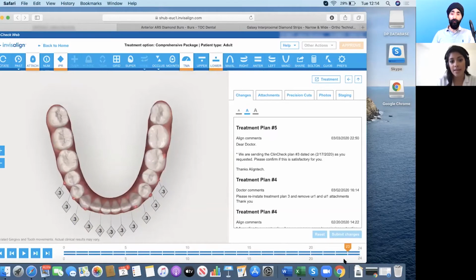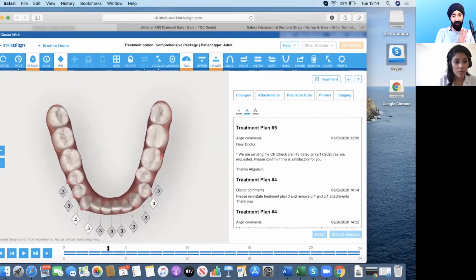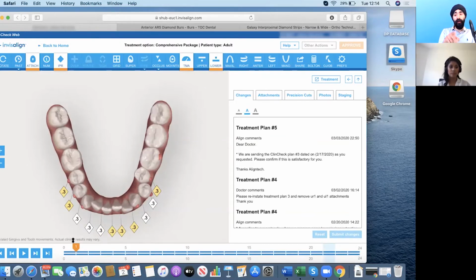Yeah, exactly. Any deviation in this case, for example, that lower left premolar and molar, if you just go back to when it was a bit crowded? So tell us between the 2 premolars. That's a tricky one, because if I was to start stripping the mesial surface of that lower left second premolar, then that would eventually be the buccal surface, right? If I put a double-sided strip there between the lower left 4 and 5, you're actually removing it from the buccal. That's not where the contact is.